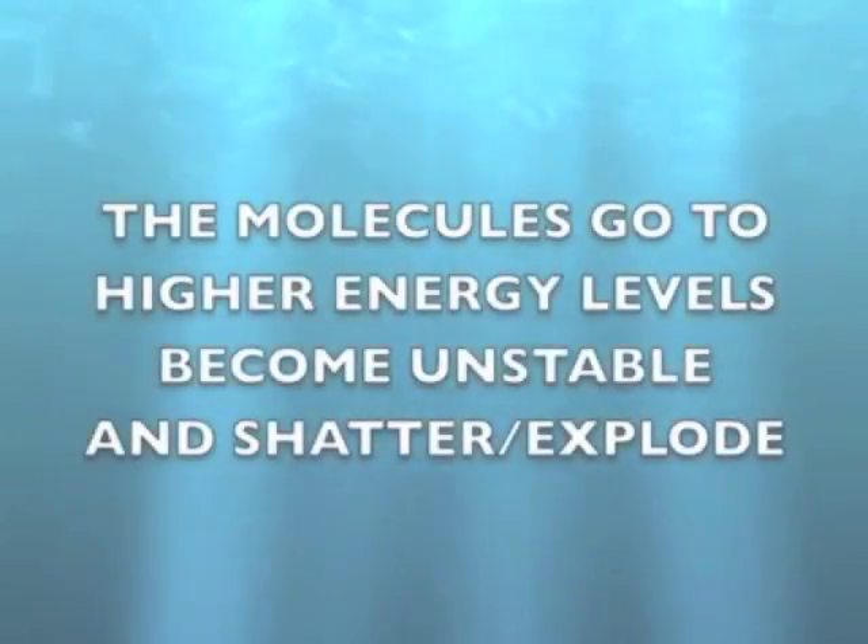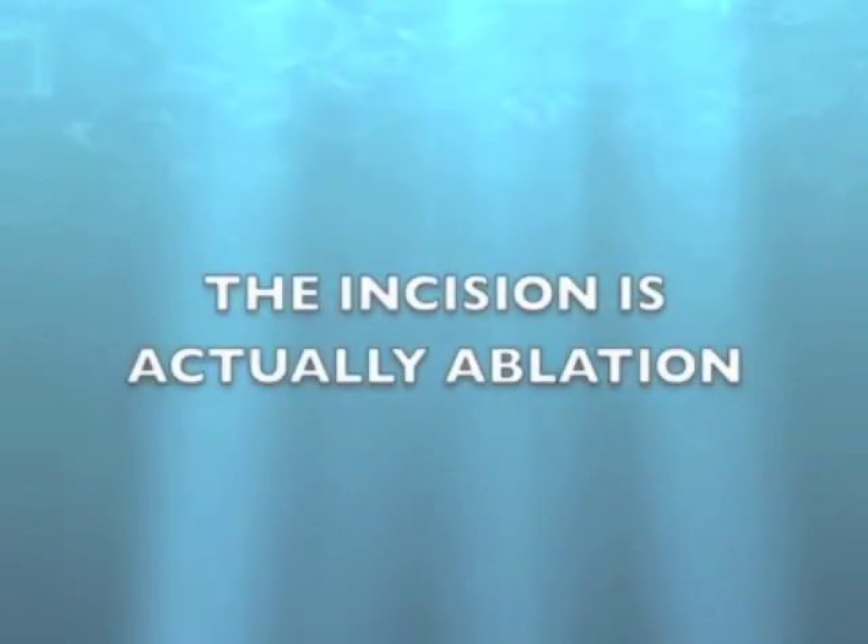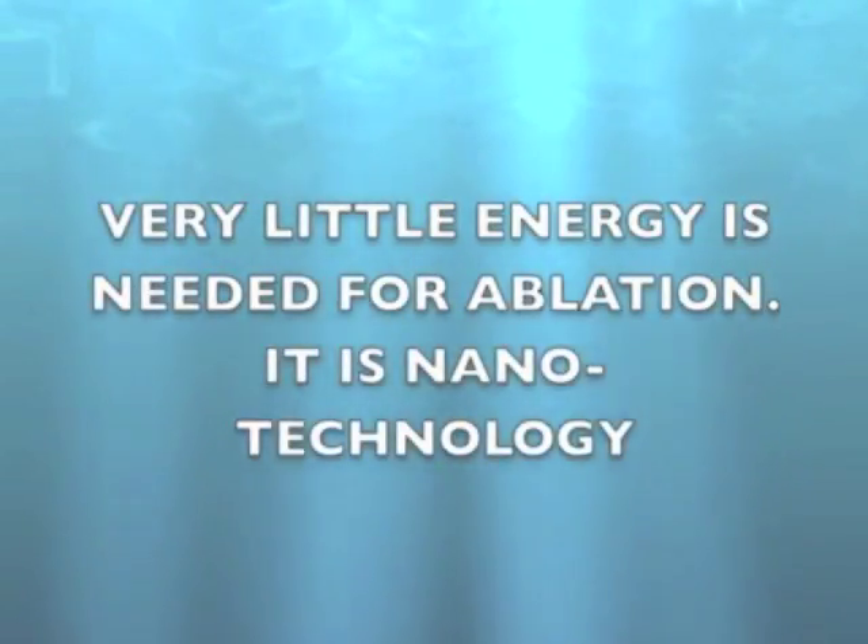The energy is transferred to the molecules of the tissue by resonance. The molecules go to higher energy levels, become unstable and shatter — they explode. The tissue disappears. There is no collateral damage, there is no burning, so you can clear the path very easily.